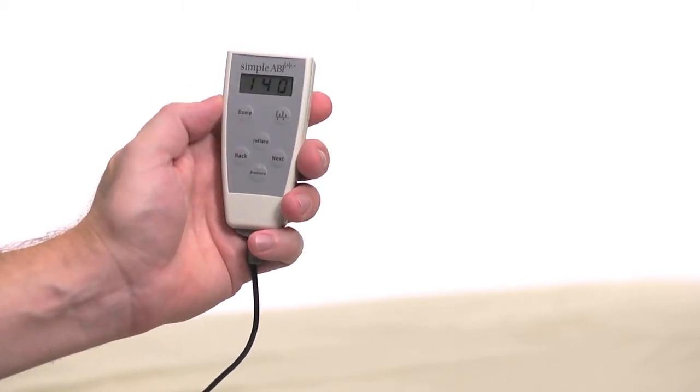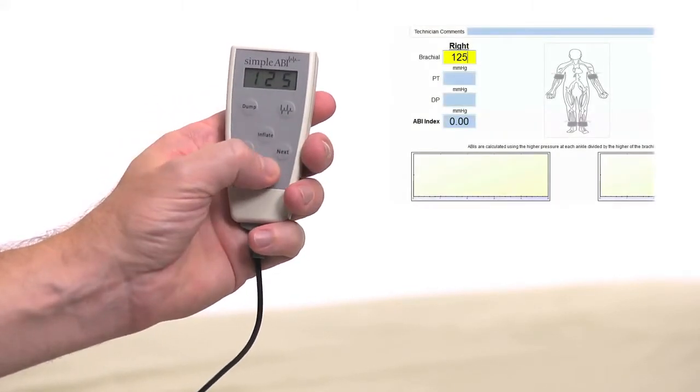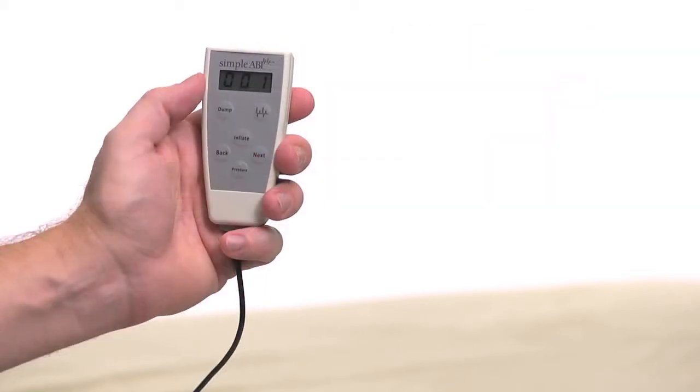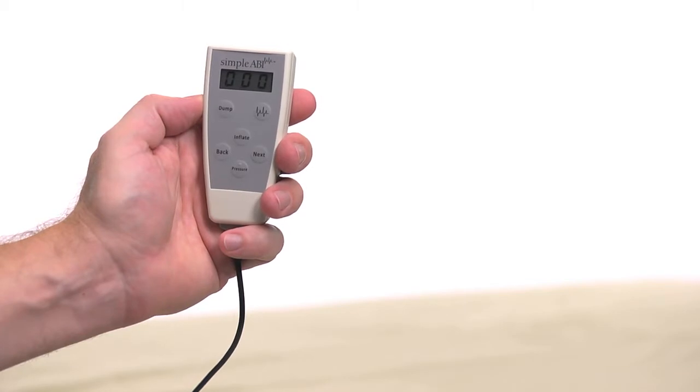Release the Inflate button and the cuff will automatically start to slowly deflate. When you hear the Doppler signal return, press the Pressure button and the pressure will be entered in the right brachial field. If you want to repeat the pressure measurement, simply repeat the process and the new pressure will replace the previous one. When satisfied, press Next on the remote and the system will move to the dorsalis pedis or DP. Please note: pressing Dump or Next will dump the pressure in the current cuff.